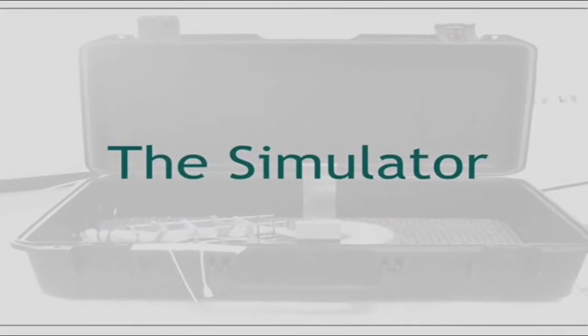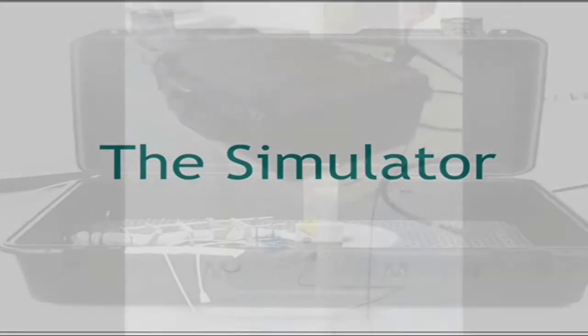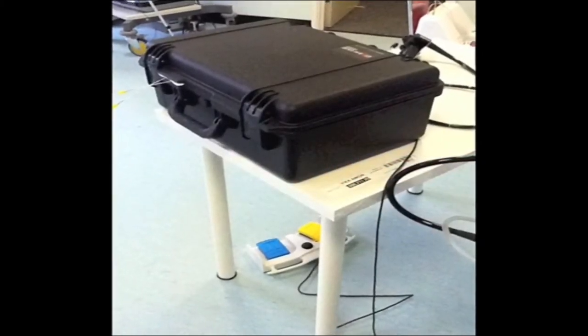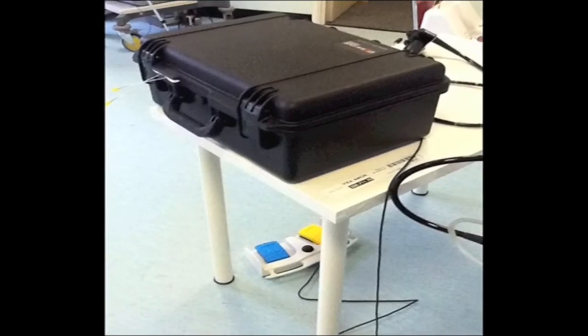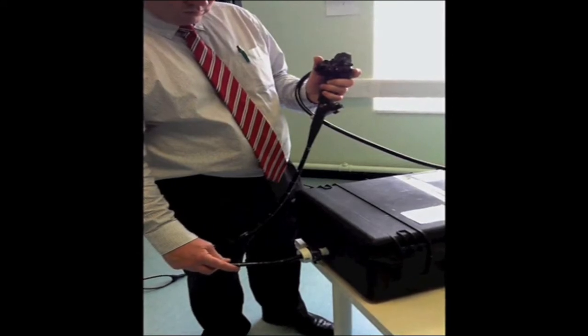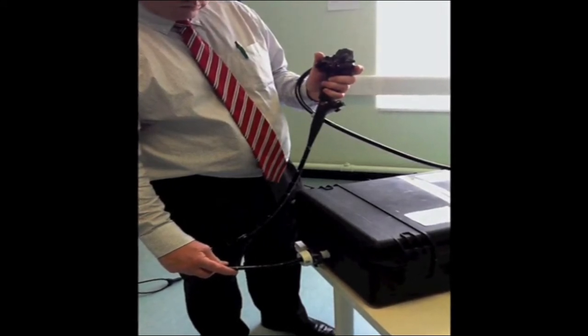Firstly, we shall look at how the simulator is constructed. The simulated casing is a portable polymer suitcase with a hole made in one end to simulate the anus. This hole is cannulated with a 15mm laparoscopic port and secured internally with a plastic ring clip.